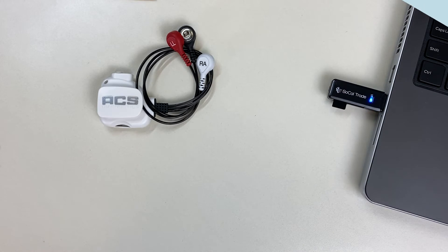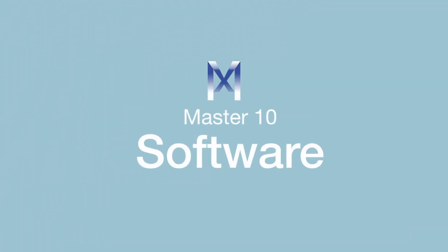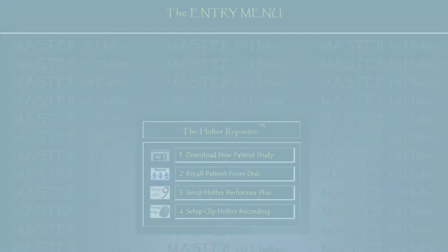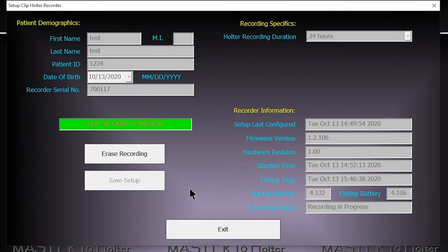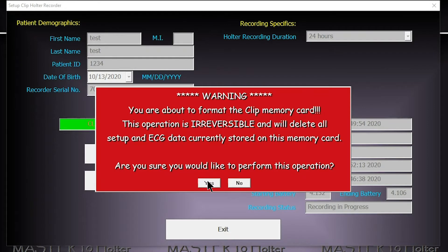The card must be programmed before applying the leads to the patient. Launch the Master 10 software and click any key. Click on the setup clip holter device option number 4. Upon clicking option number 4, erase the recording and follow the steps to format the memory card.